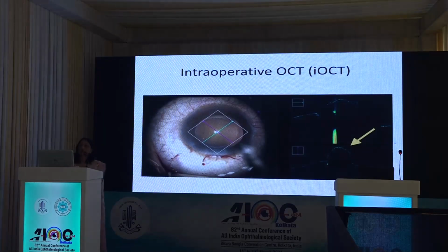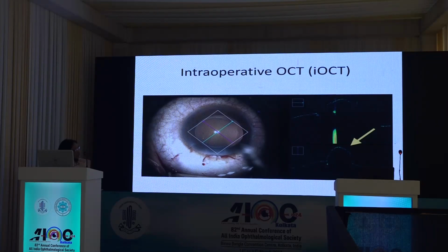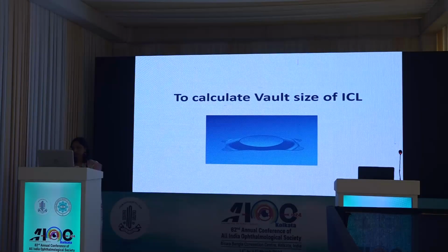Now, intraoperative OCT is a newer concept. We are still exploring the applications. But in this patient, it had a PCR, and here you can see that there's a vitreous mound that is prolapsing through the PCR. So you can visualize these things and manage the case in a better way.